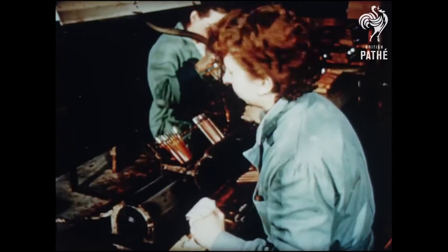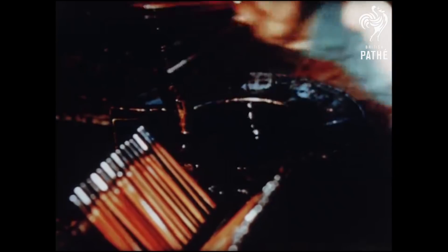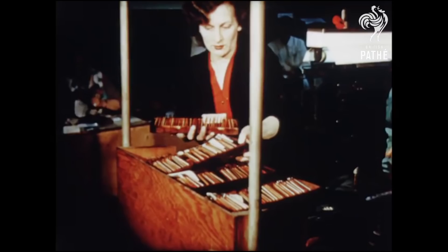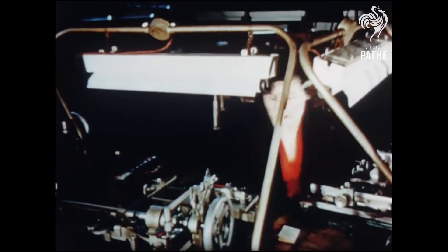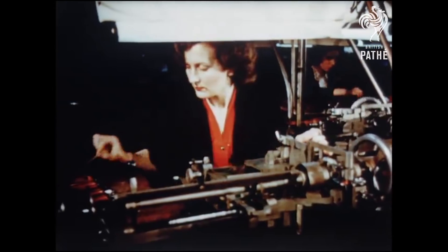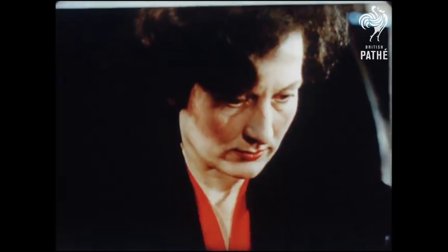Calibrating the thermometers is done by dipping each one in a tank of water controlled at a fixed temperature. A cut is made on the glass of the new thermometer and this is repeated for a whole scale. A graduating machine is adjusted to the marks and a knife makes all the graduations through wax.